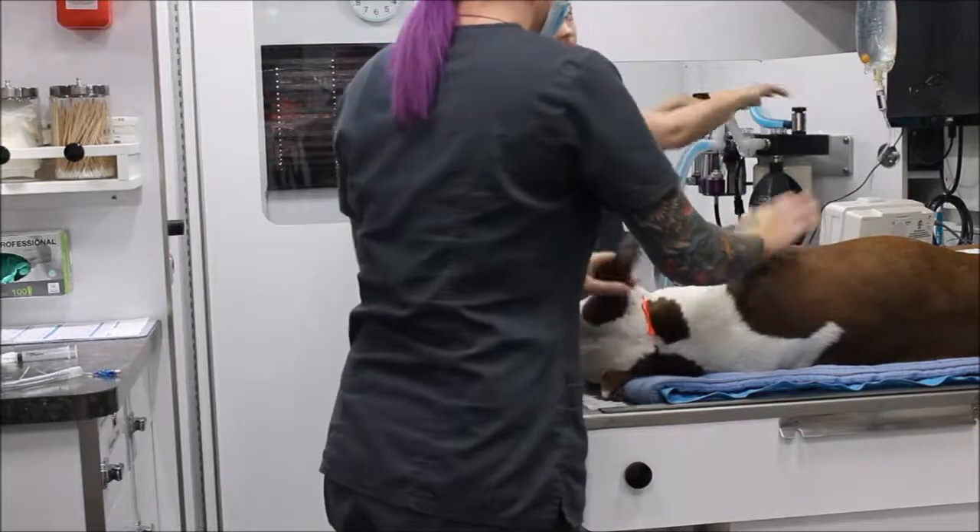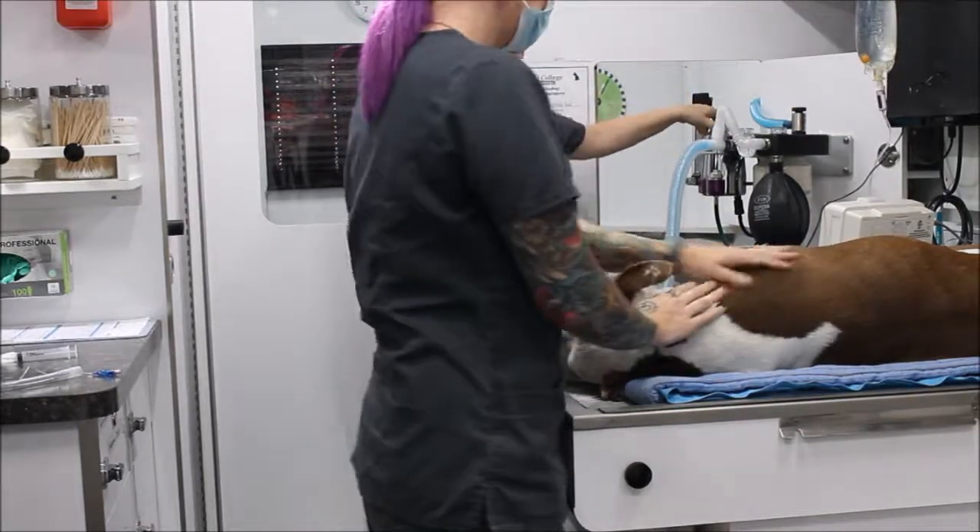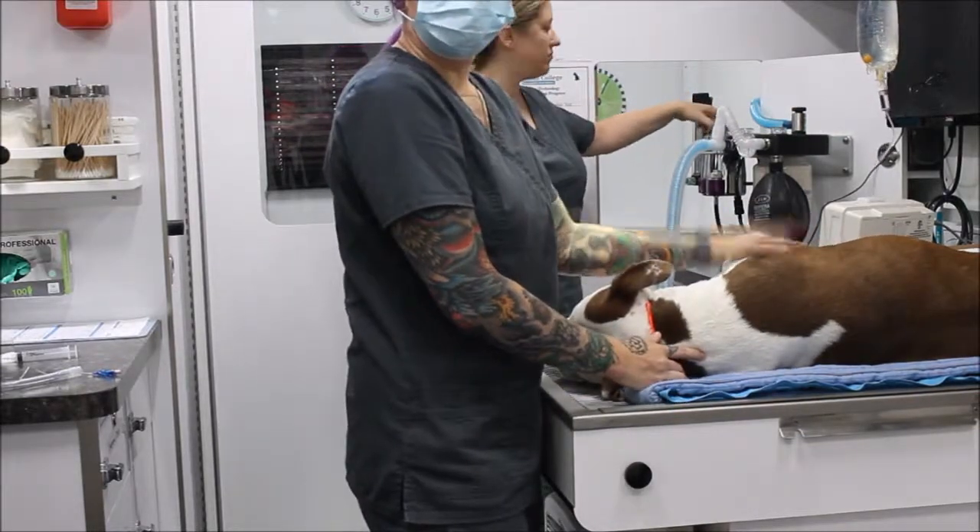Now that we are finished, I've removed my syringe and our patient is ready for surgery.